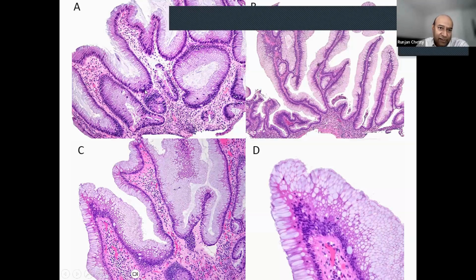And at closer magnification and in different areas here, again, you'll see there's a degree of hyperchromasia, a little bit of obliquity of sectioning. But even if you look at the top here, you'll see that the nuclei are starting to look a little bit more angry. Again, another very bland-looking lesion cytologically, but architecturally reasonably alarming, villiform in appearance, and mild stratification focally.